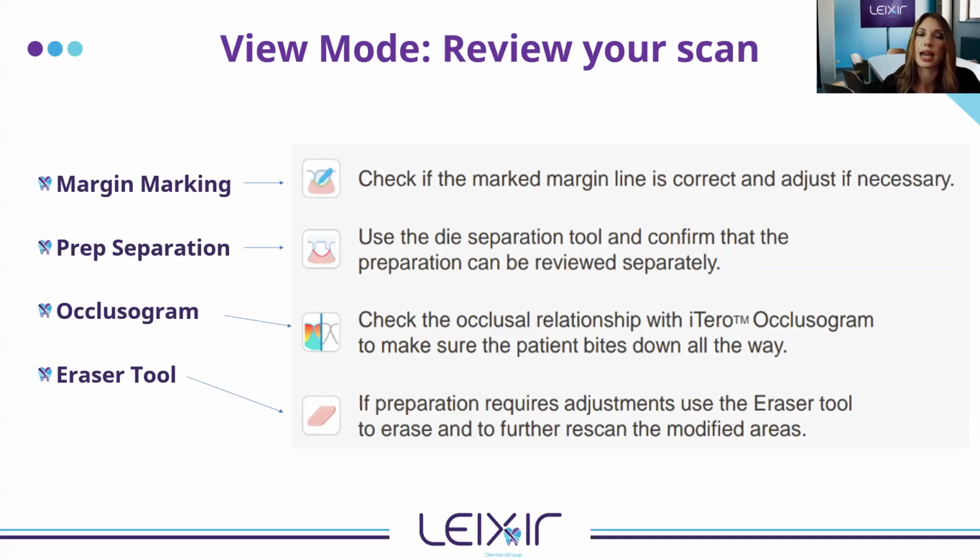So you need to make sure that if you select this tool and you don't want to use that margin and you just want the lab to mark the margins for you, you have to hit that red X and delete the margin, and then you can go back. Okay, so I'll show you that when we do the live demo, and it'll make a little more sense.